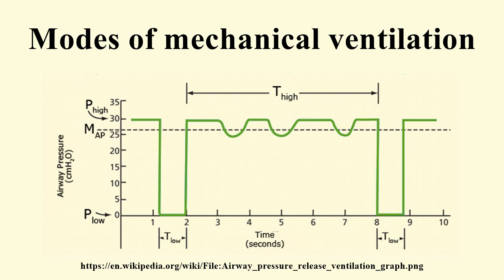Mandatory minute ventilation. Mandatory minute ventilation allows spontaneous breathing with automatic adjustments of mandatory ventilation to meet the patient's preset minimum minute volume requirement. If the patient maintains the minute volume settings for VT x F, no mandatory breaths are delivered. If the patient's minute volume is insufficient, mandatory delivery of the preset tidal volume will occur until the minute volume is achieved.